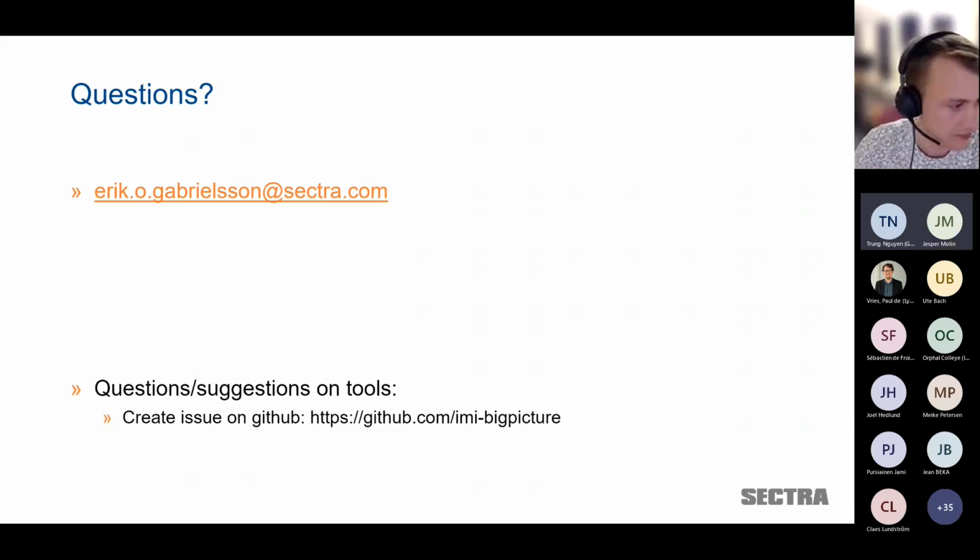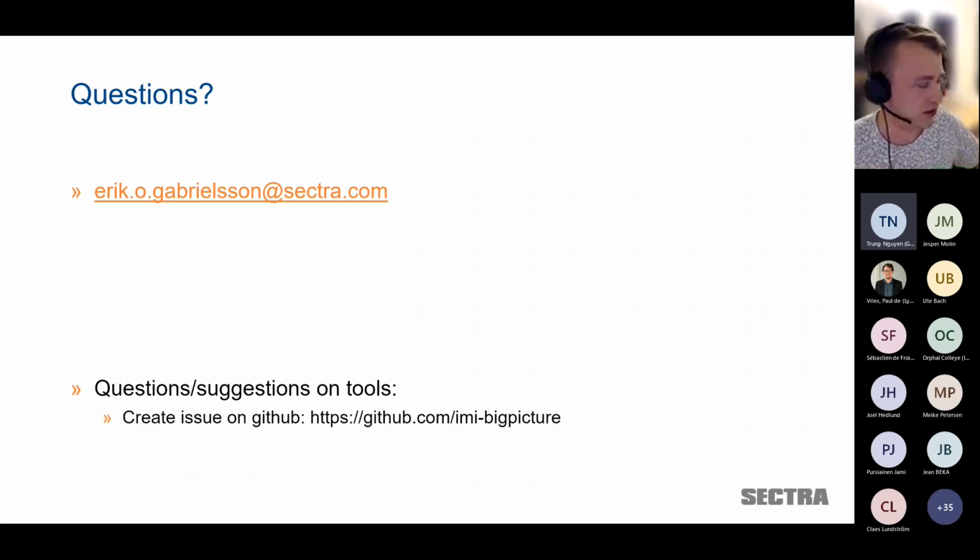Yes. And then Joel Pettersson from Östergötland asked, we, Region Östergötland, converted some of our NDPI files to DICOM with a popular tool for DICOM conversion. And the DICOMizer described here was an order of magnitude faster. What makes this DICOMizer so much faster compared to the other software? Yeah, it is that we do it losslessly, so we don't have to decode and recode. And also, if we are decoding or recoding, we use a quite fast JPEG coder. So that is the reason.